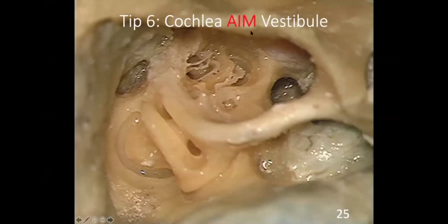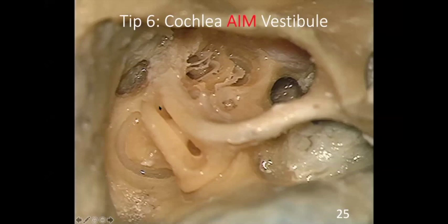The relationship of the cochlea to the vestibule: cochlea is not just anterior but anterior, inferior, and more medial compared to the vestibule. You can see the oval window and facial canal, the first genu, the second genu, and the vertical part of the facial nerve. The cochlea's three turns — basal turn, middle turn, and last turn — are seen here. Remember: cochlea is anterior, inferior, and medial to the vestibule.